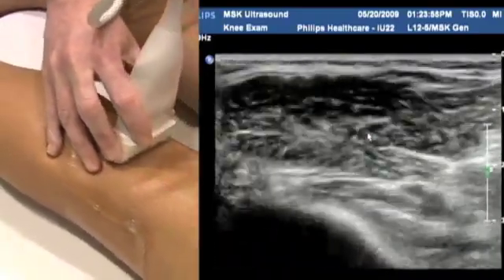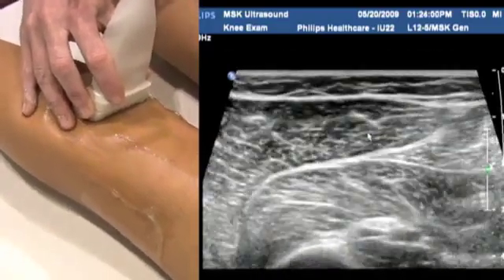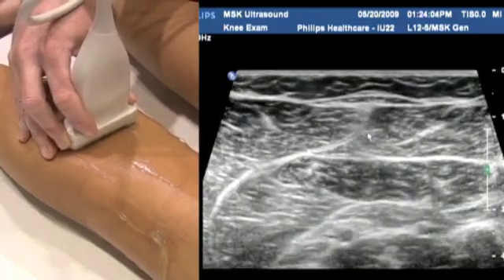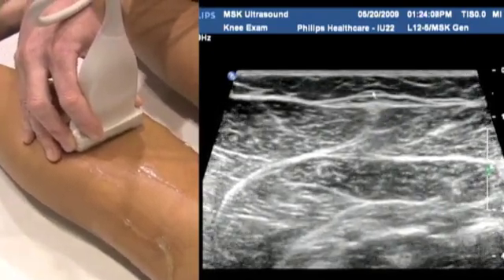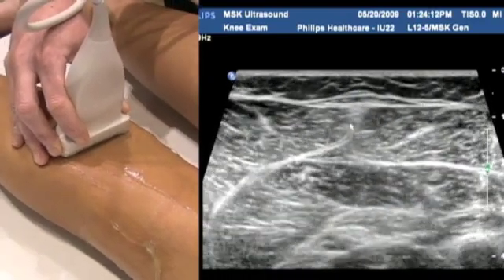And again, more distally, you can extend your study if the patient certainly has pain that extends down in this area, down into the proximal calf region. You can see here, this is where the short saphenous vein will sit. Again, you can extend your study to be looking for thrombosis in that.